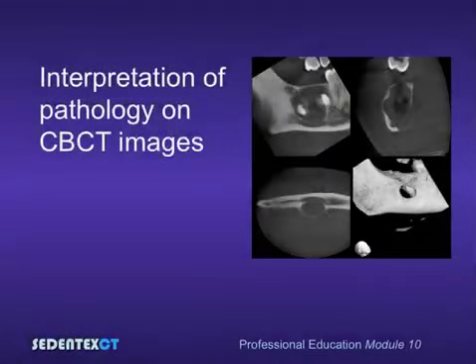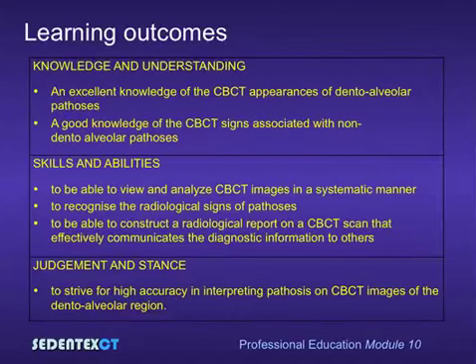Module 10, Interpretation of Pathology on Cone Beam CT Images. The anticipated learning outcomes from this module are as follows.